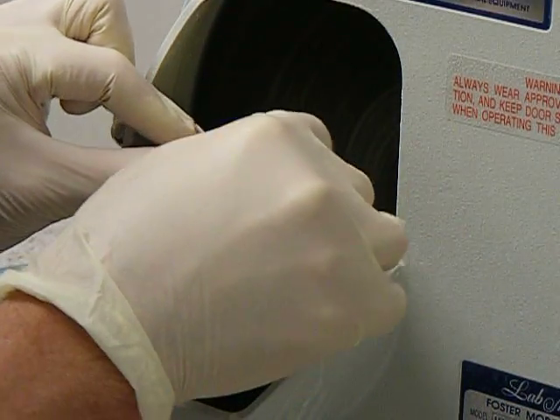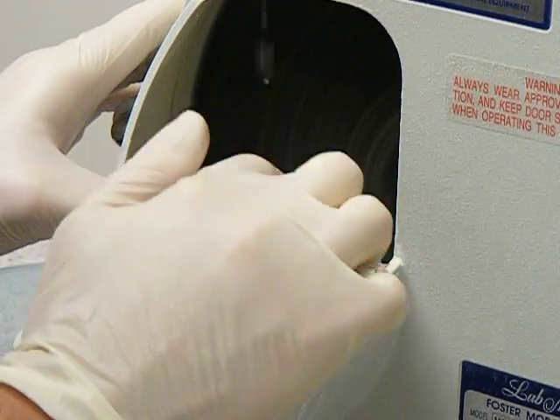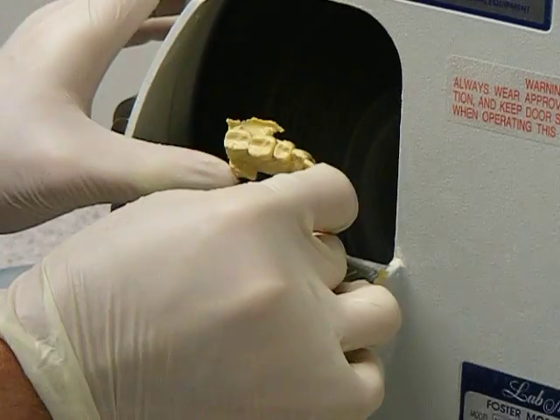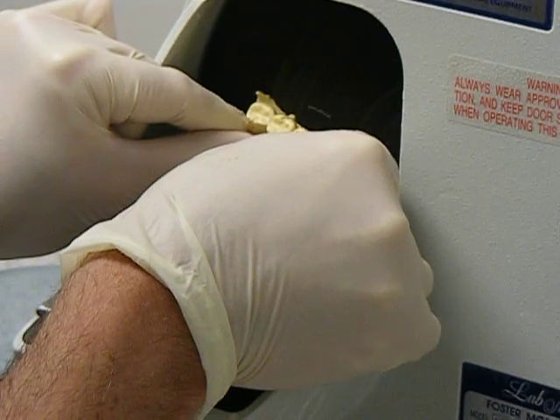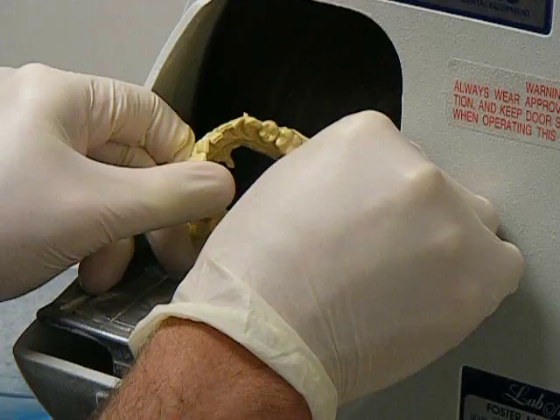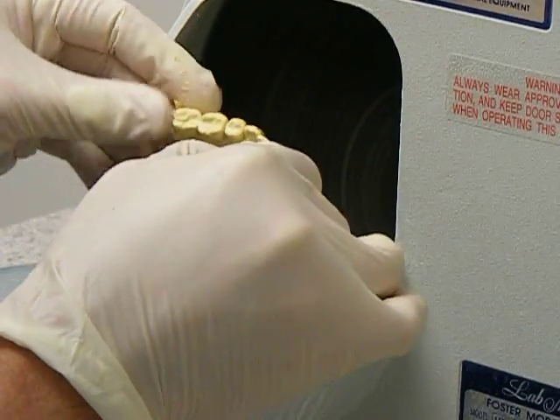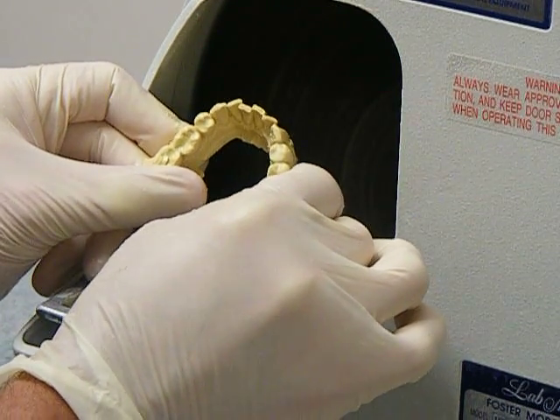You can trim the sides by placing it on the table and advancing it towards the disc. It's hard to see the buccal side of the teeth from here, so you may want to tilt the model — but make sure that you have a good grip on the model when you do so. That is about as rough a trim as we want on our models, and then you'll just rinse it off after this.